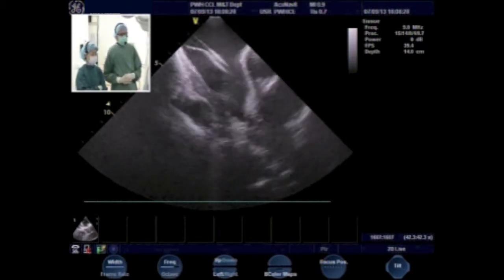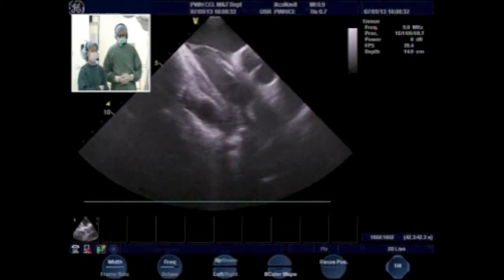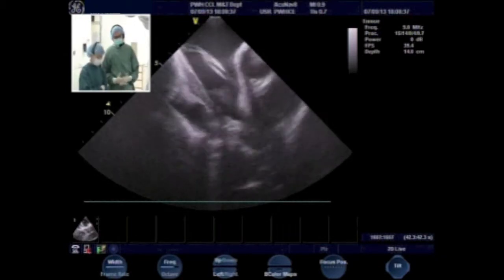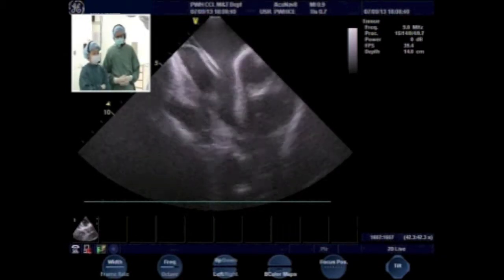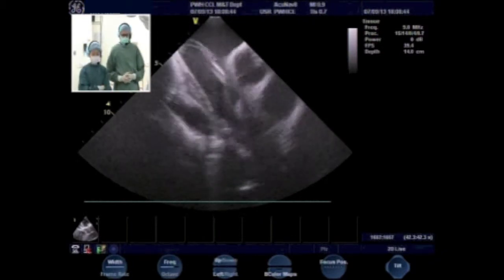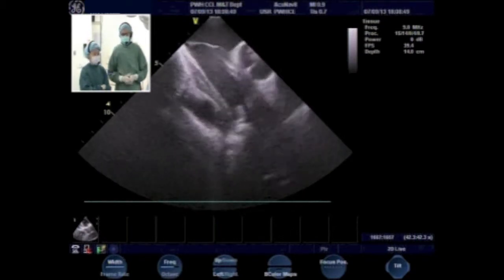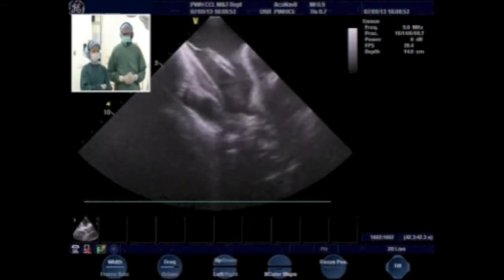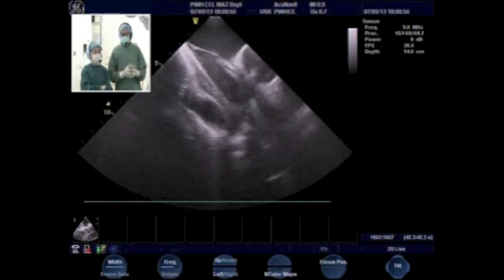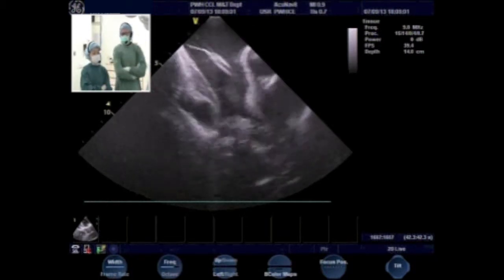Can we proceed? Last, can I ask why there's a discrepancy in your measurements compared with the baseline echo done early on? Is it because the airway pressure was a little higher now, which distends the atrium, and then the atrial septum also separates a bit apart? My measurements were actually done on the TOE, the workup she had. We looked through all the views, and we found some views where you can see it was up to 24, in some views 16 and 24, so an average of 20.